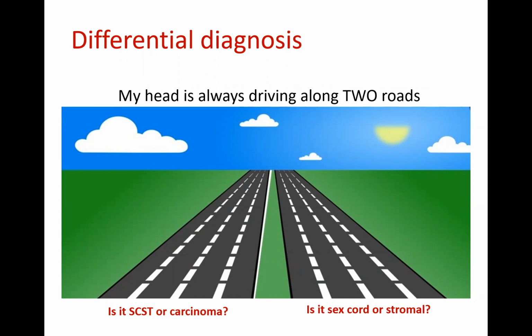Those of you who signed out with me heard me say many times, don't order a stain unless you have a question. So what is the question in your mind right now? The question on my mind, I'm looking at a tumor, I'm trying to decide, is it a sex cord-stromal tumor or is it a carcinoma? So this is one line of thinking.